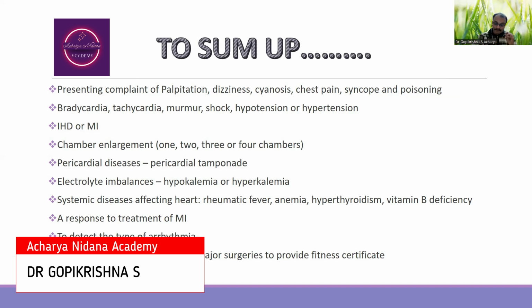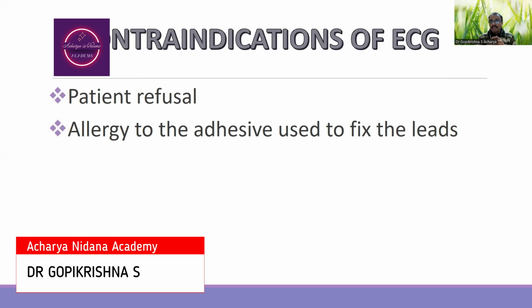As a pre-operative assessment in case of major surgeries, we are going to do the ECG to provide the fitness certificate. As far as contraindications, there are no major contraindications as such. When the person is refusing to do the electrocardiogram, then probably we are not going to do that. And when the person has an allergy to the adhesive used to fix the leads, in those situations, we are going to deny doing the electrocardiogram.